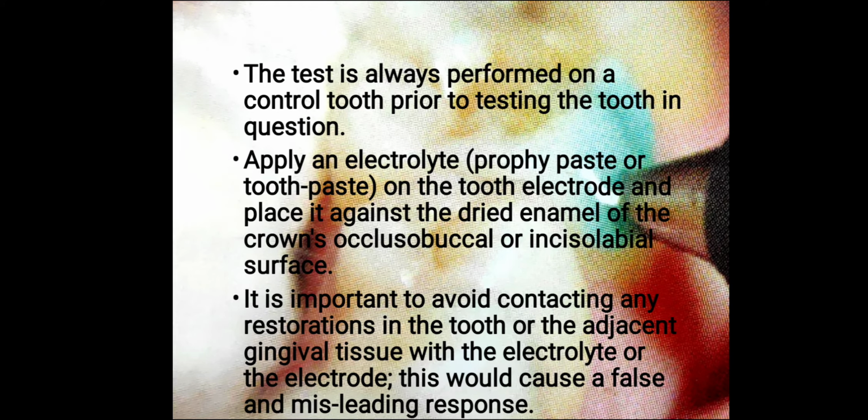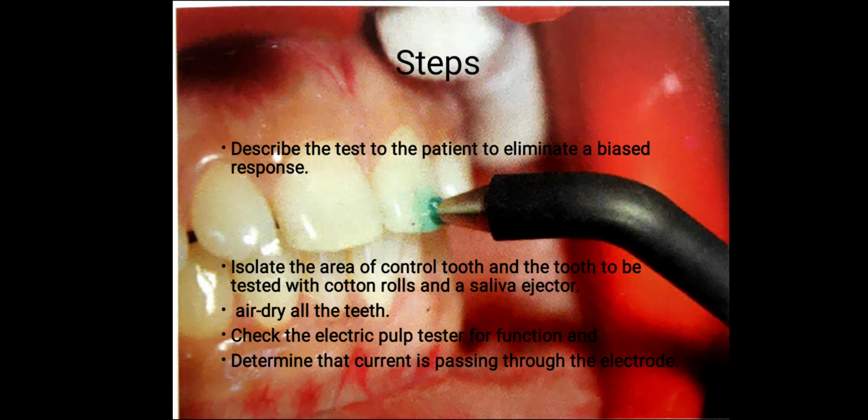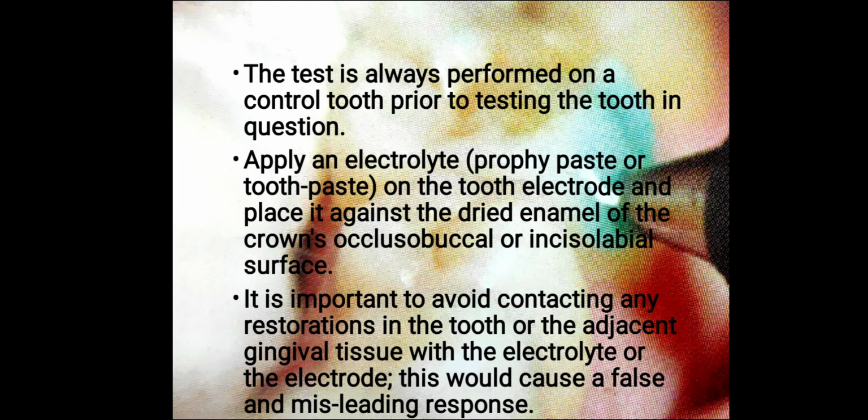It is important to avoid contacting any restoration in the tooth or adjacent gingival tissue with the electrolyte or electrode. This would cause a false and misleading response. Hence, it is avoided.